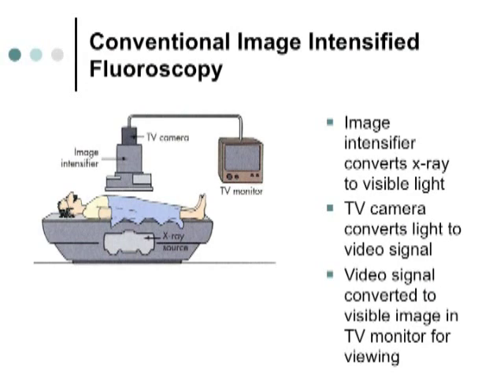Did you use mirror optics, where you looked actually at a mirror on the image intensifier rather than a television monitor? So there was a system of mirrors attached to the image intensifier, kind of like a projector that has the mirror on it. You'd look directly at a 4x4 mirror at the output phosphor of the image intensifier to see the image.